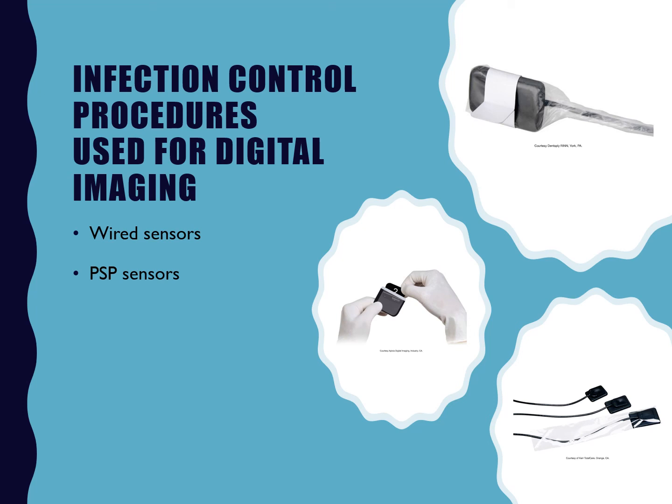Okay. The wired sensors have these little sleeves that go over them. The PSP sensors, you can see this picture. Let me circle it here. This is a PSP sensor. It's kind of like a little piece of film that you can use over and over again. And it goes into a sort of scanner system, you feed it into, and you can get your digital images that way.